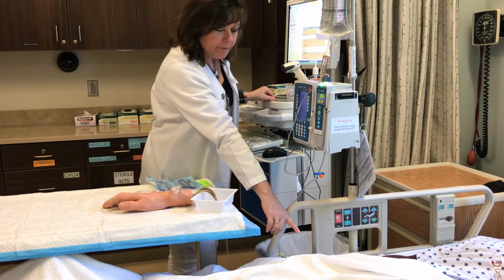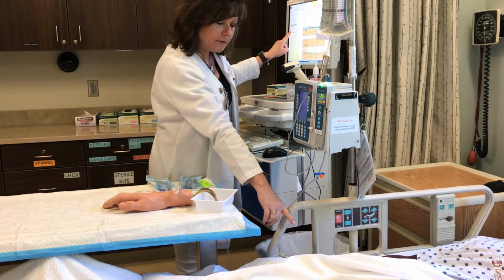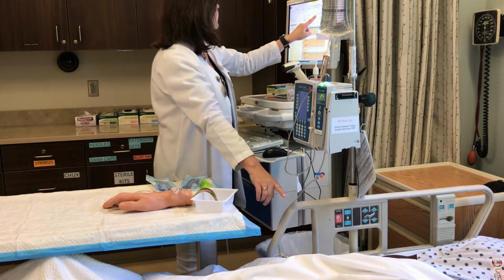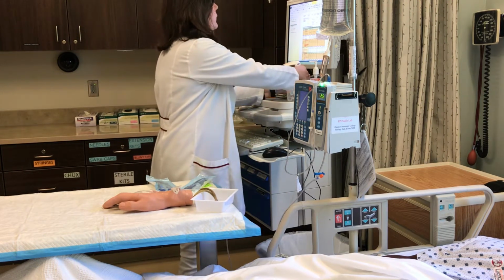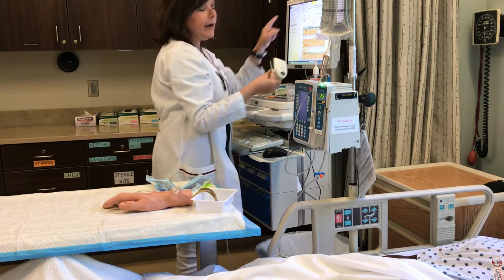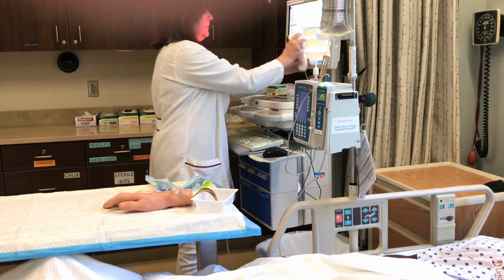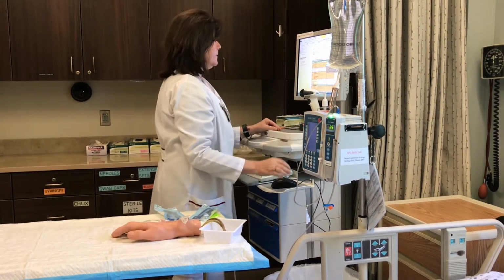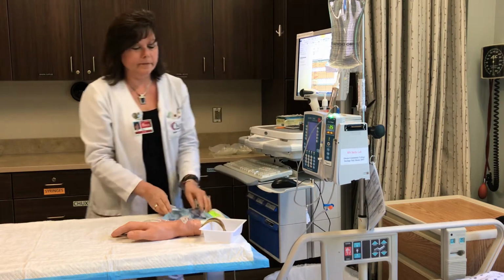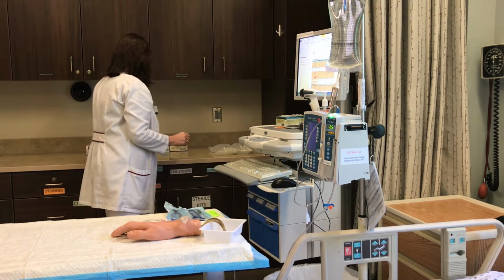Could you state your name for me? Diane Curtin. Okay, and your birthday? June 14th, 1941. And do you have any allergies? No, I do not. All the information matches my MAR, and now I'll scan her band. Apply clean gloves. Gloves will be located at the head of the bed or on the side here.